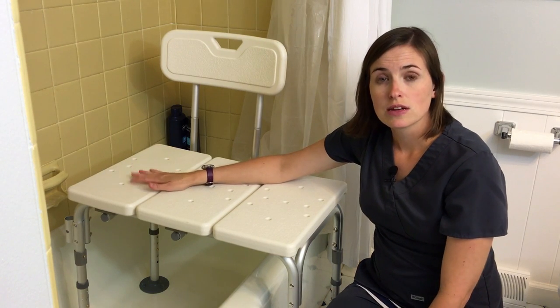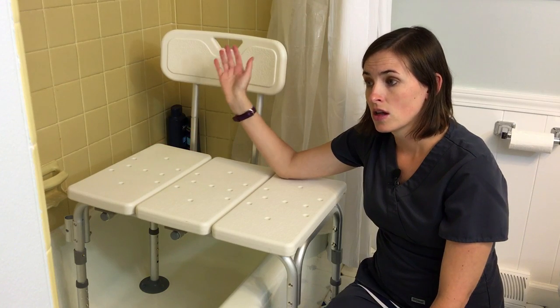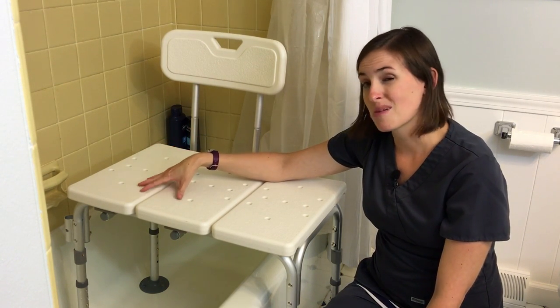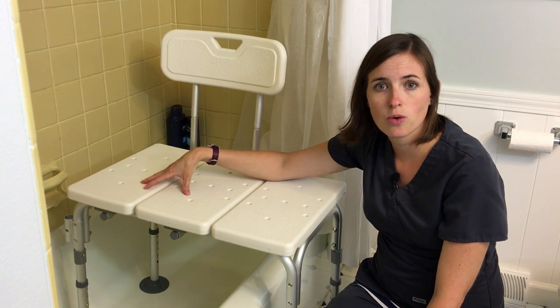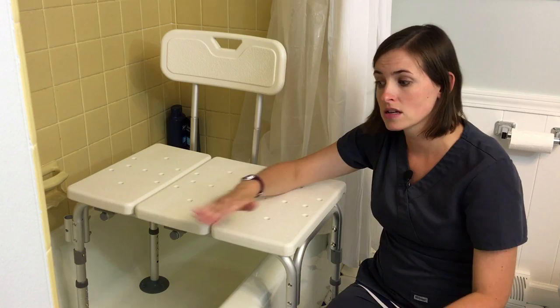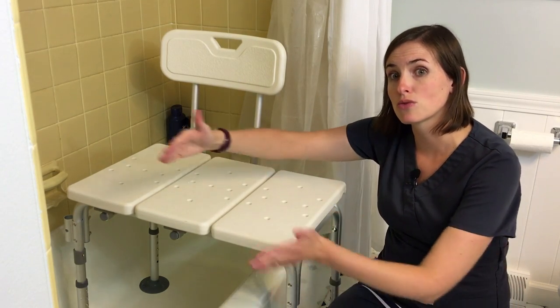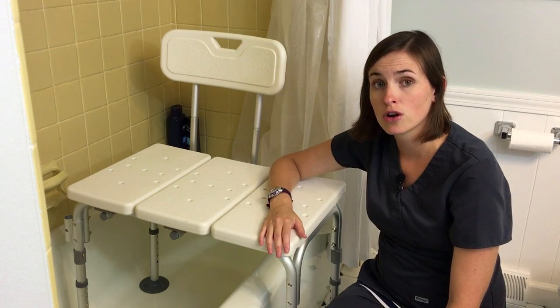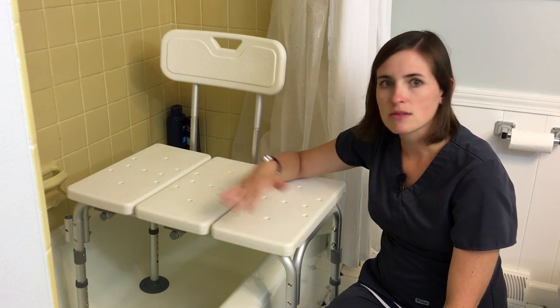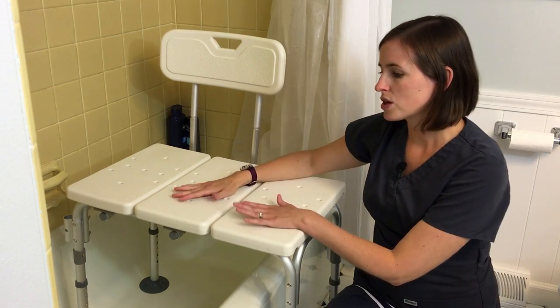Also when considering placing this, you need to know the person that's going to be using the bench and consider their leg length and how they're able to move. For example, if somebody's had a knee replacement or an injury that may limit their ability to bend their legs, this tub bench can go quite a bit farther back into the tub to accommodate room for them to slide their legs over without bending them. For me, I put this right in the middle because I can bend my knees just fine — it's more of an issue of stability.